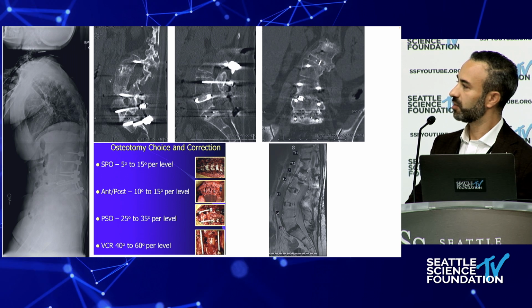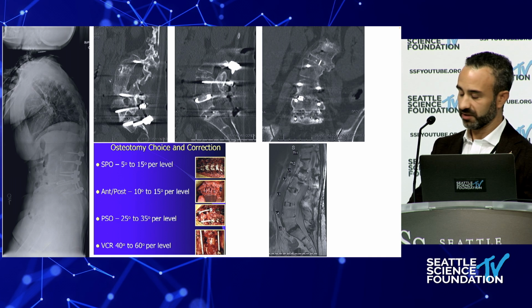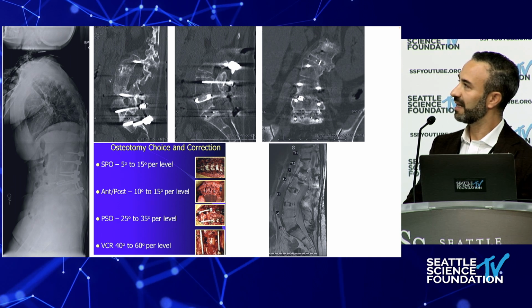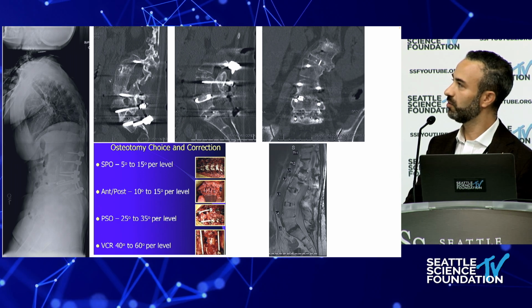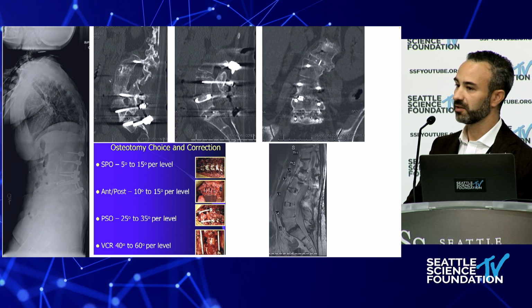So again, looking at our traditional options on how to approach a patient like that, obviously, the thought process would be potential osteotomy for a correction of larger sagittal deformity. As we've talked about, anterior column support potentially gives us a very, very powerful tool. I call this the window of opportunity with a big pseudarthrosis.